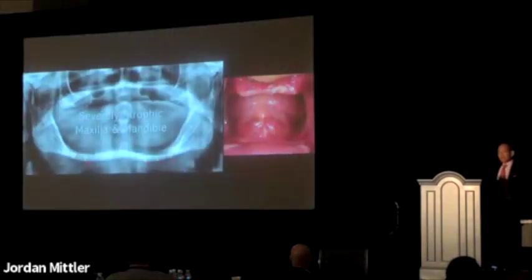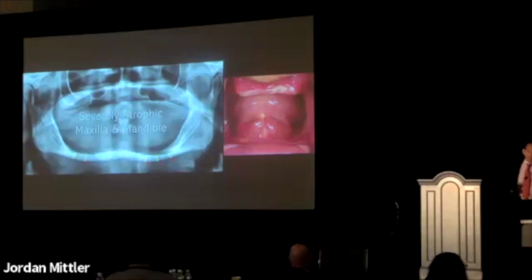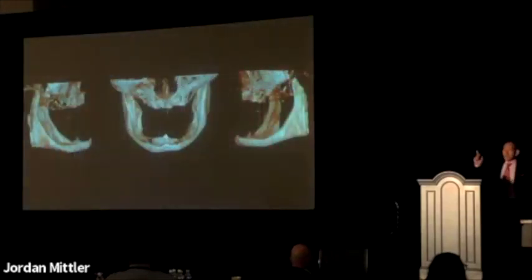So here's a case, a lot of times you don't even need a graft. This patient was referred to me. The American Association of Oral Maxillofacial Surgery defines the severely atrophic mandible as a mandible less than 10 millimeters. This is a 3 millimeter mandible. Have you ever seen a 3 millimeter mandible in the posterior mandible? A mandible prone to fracture. So I was referred and asked to place implants. You can see it's completely hollowed out and shelled out.